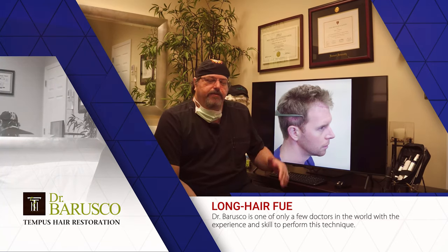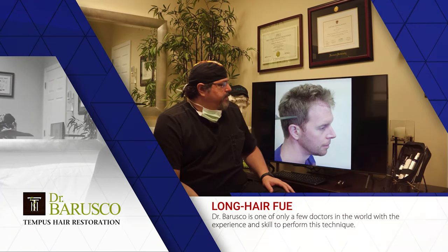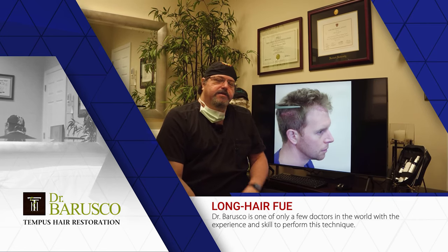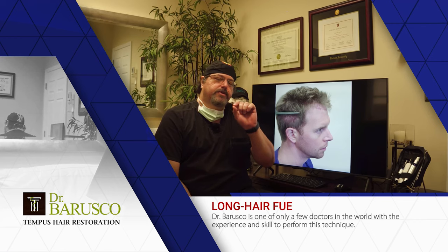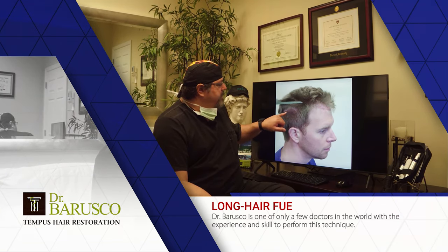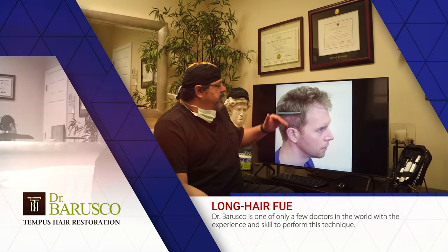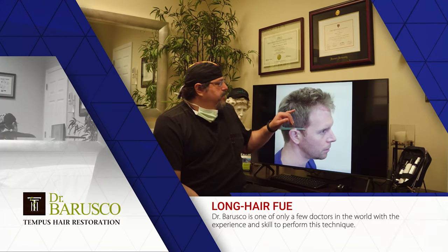The second variant of the FUE that we've been performing for a while is called the no-shave FUE. We don't shave the donor zone completely, and we don't shave the top. What I do is go in between the hair prior to surgery and clip with a pair of very delicate scissors, randomly clipping the hairs I'm going to remove. So the hair that's removed is short, like a shaved FUE, but by selectively clipping between the hairs I'm able to leave enough donor length that the patient can hide the surgery right away. As I move my comb here, you can see the little dots from where the FUE grafts have been removed, with enough hair length left untouched to cover it.